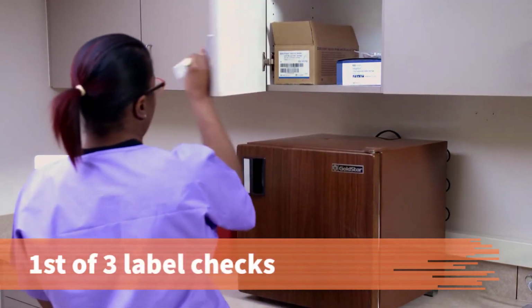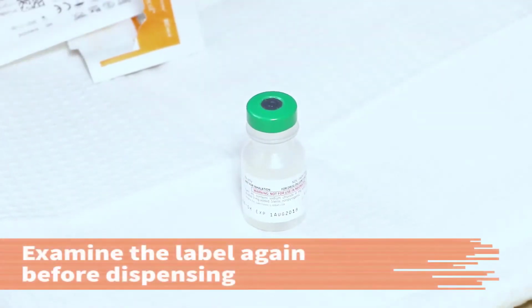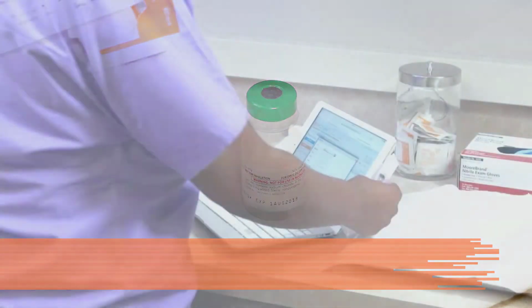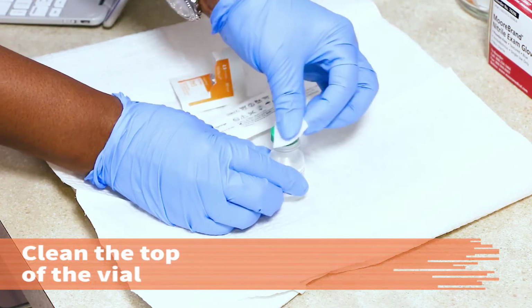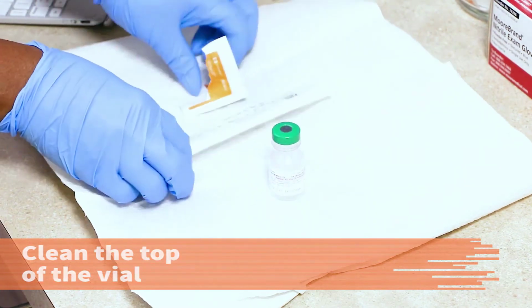This is the first of 3 label checks. Examine the label on the vial of medicine again just before dispensing the ordered dose. Make sure the strength on the label matches the order, or that you dispense the correctly calculated dose. Clean the top of the vial with the alcohol wipe using a circular motion. Place the vial on a flat surface.